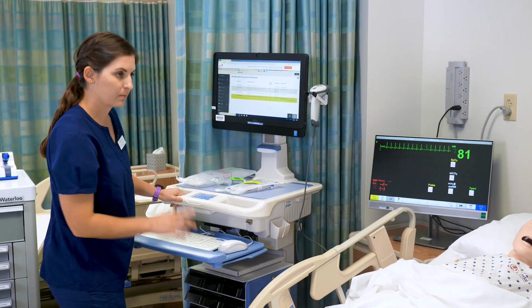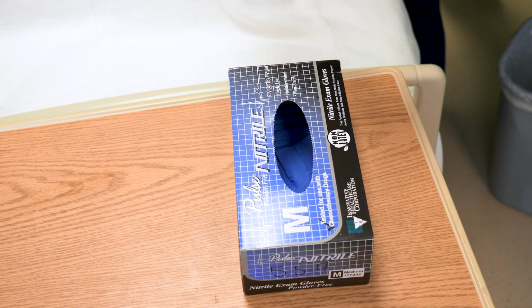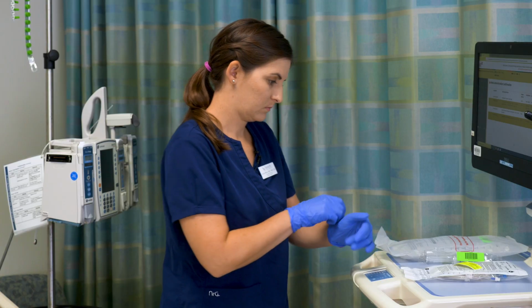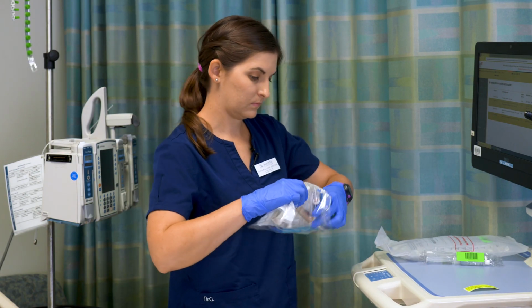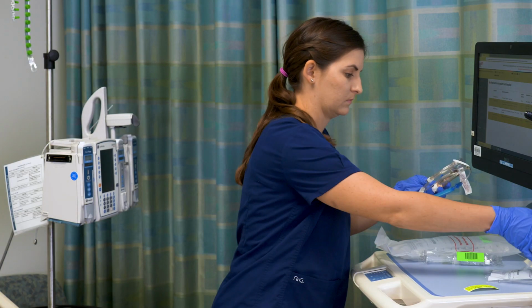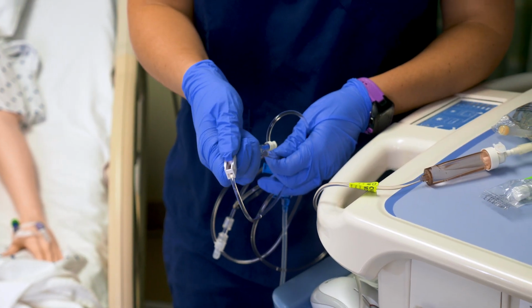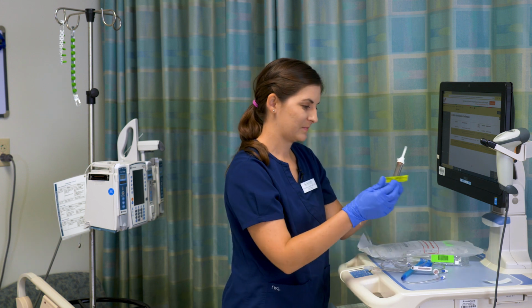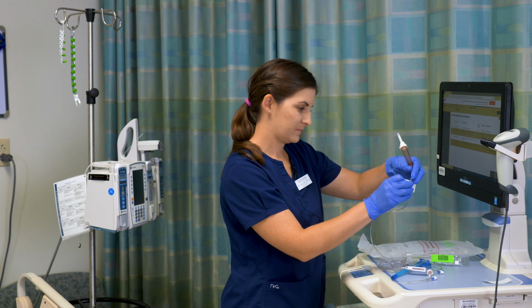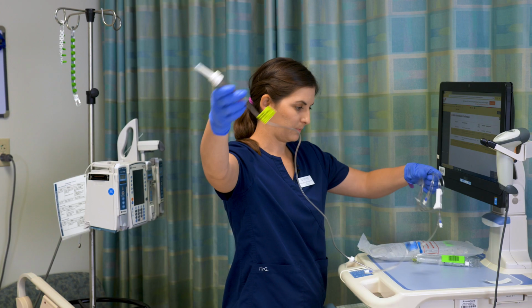Okay, Ms. Duncan, I'm just going to come around to the other side where your IV tubing, or IV pump, is. So I'm going to go ahead and put on my gloves and then get my IV tubing ready. I want to make sure as soon as I pull my tubing out that my roller clamp is engaged. I'm going to attach my label to my tubing.